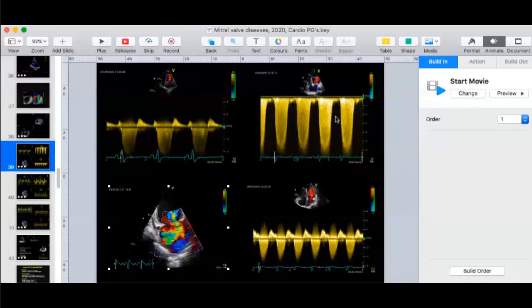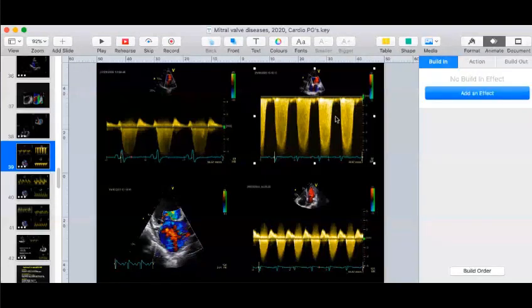Fine. Also, the shape, a triangle, is more dense. I'll come to that. You're correct. Now, how would you describe this image? It's an MR jet. Fan shape or parabolic shape. Yeah. So that is the description of an MR jet. So it is going to be parabolic like this.